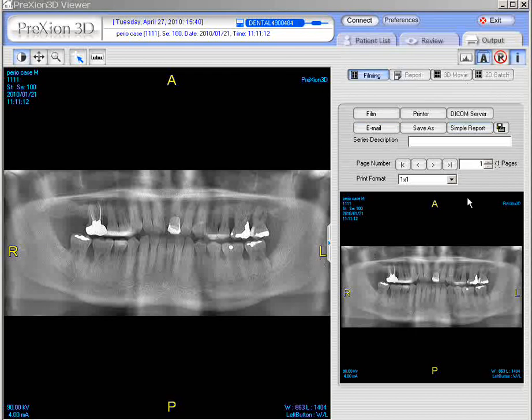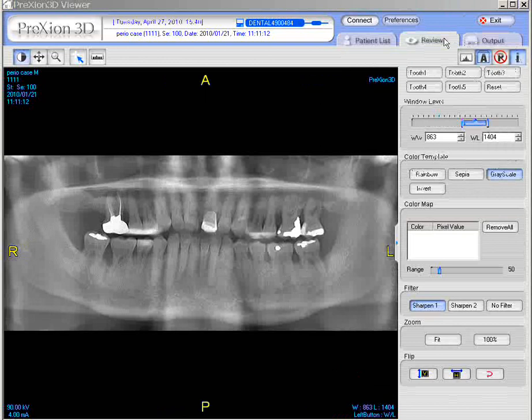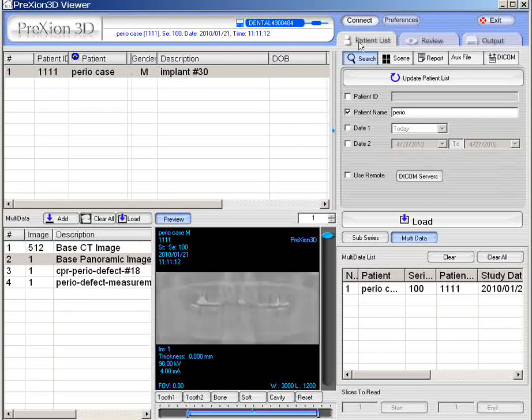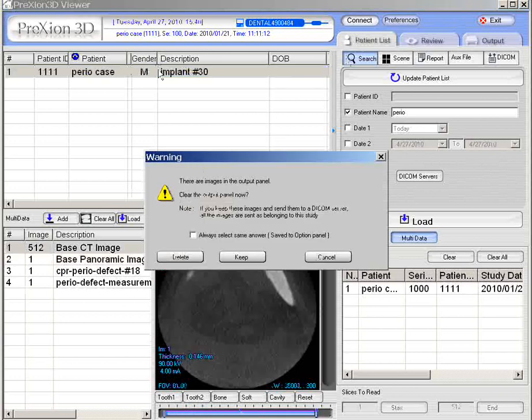Now, you can send it back to the DICOM server — meaning if you just want to rename it. You can save individual JPEG images. You probably wouldn't need to do it here with the panel. Let's go to a 3D image instead. To do that, come into Output, go to Review, and actually go to Patient List. Then you'll load up the 512 slices up here. Double-click or hit the Load icon — either one works.